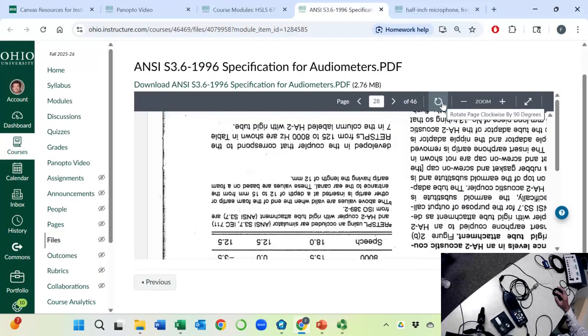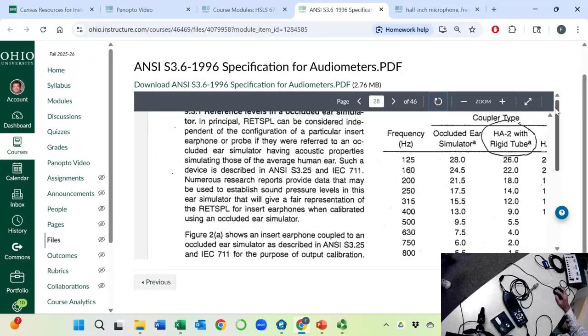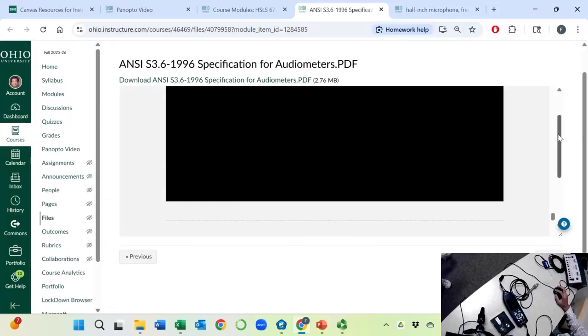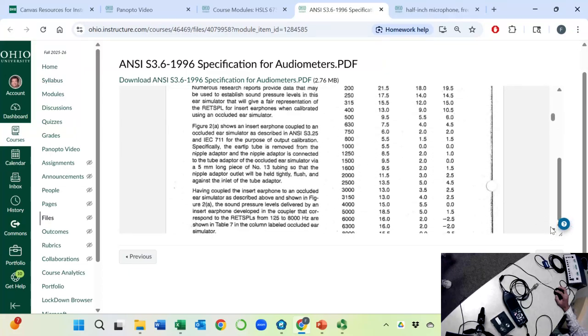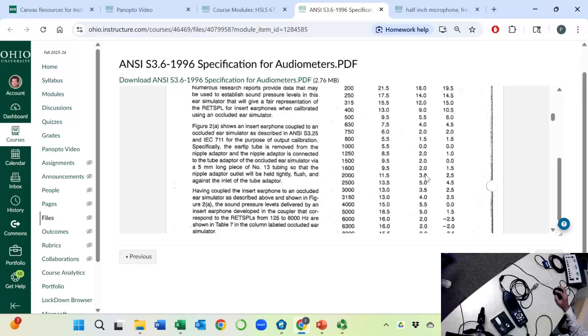I think I saw it was 3.0 for the HA2 coupler. You see that already? Yeah. But I haven't seen that. It needs to be recorded so you can watch it offline. Okay, so 2000 Hertz. Which column? Middle column. 2000 Hertz, 3.0. Here, right? Okay, 3.0.